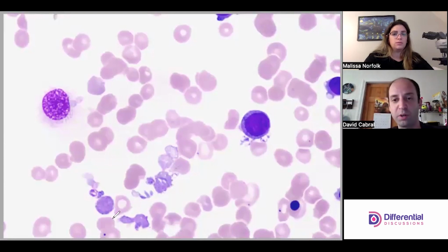Very good point too, right? Because it might not even be valuable to give a number, almost, right? You don't want to give them a false sense that this person's not a bleed risk, or even, could they even thrombose, Melissa? What do you think? When platelets are really abnormal, they can either lose functionality or gain functionality. So depending on what those platelets are doing, patients could bleed or clot. Very dangerous. So, wacky platelets. All right, so those are the platelets.